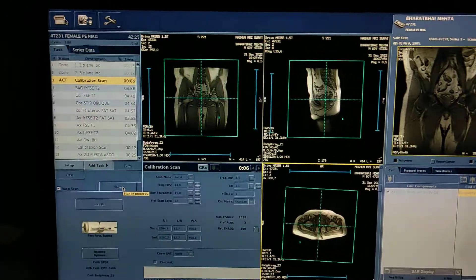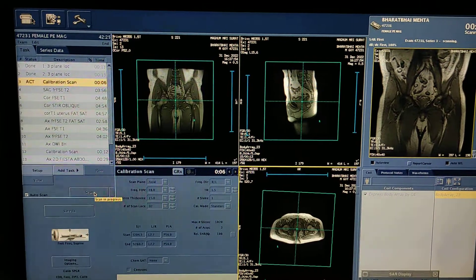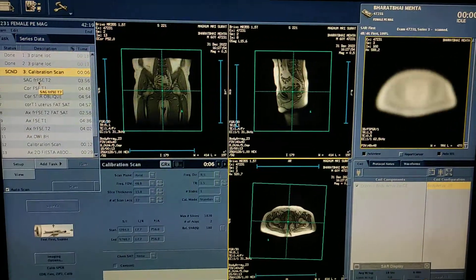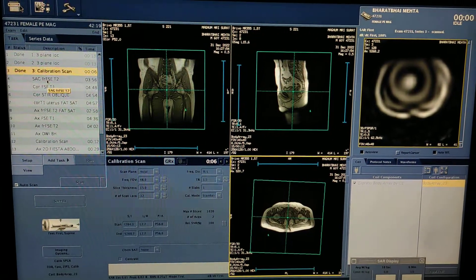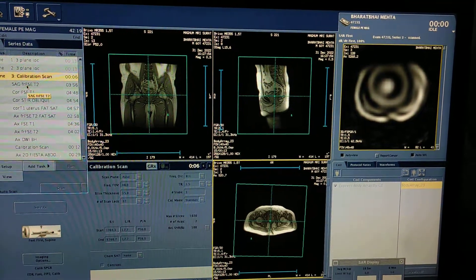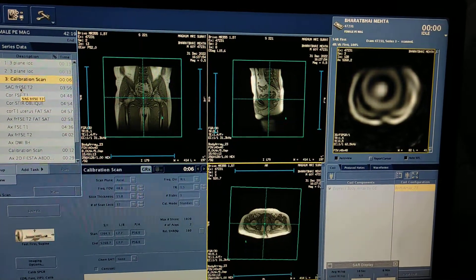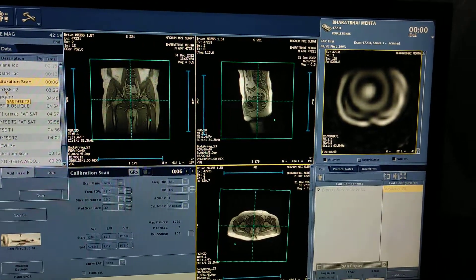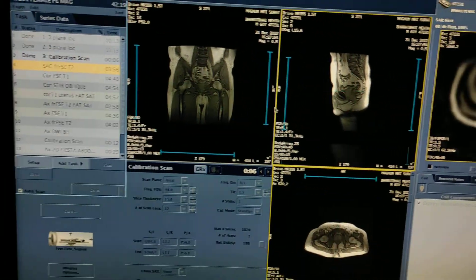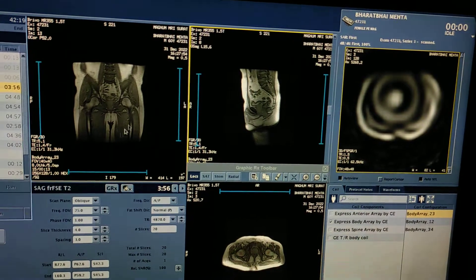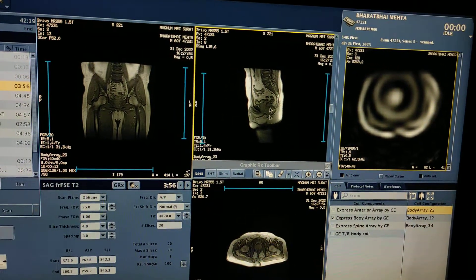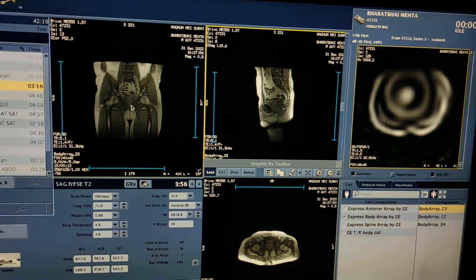Whenever you are doing male pelvis or prostate, you have to always take sagittal T2 weighted sequence first. After getting the sagittal T2, you have to plan axial and coronal on the sagittal sequence. Double click to open. If you want sagittal, you have to plan on coronal and axial — no need to touch the sagittal window.